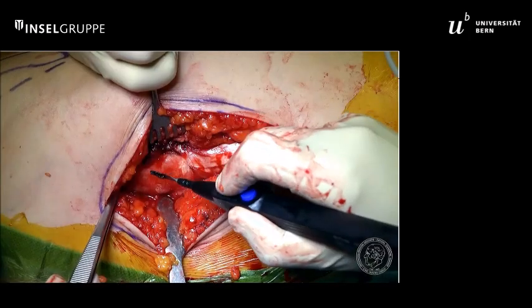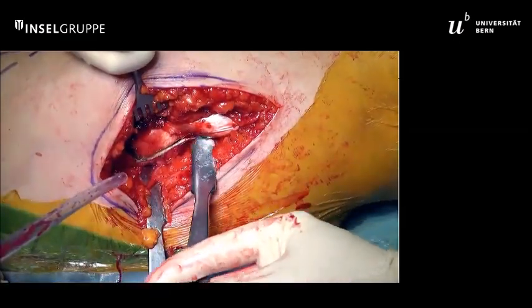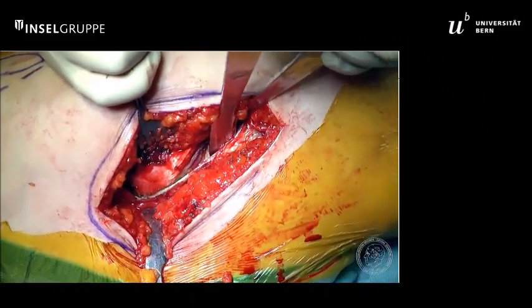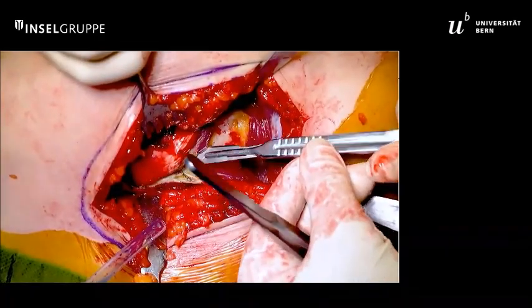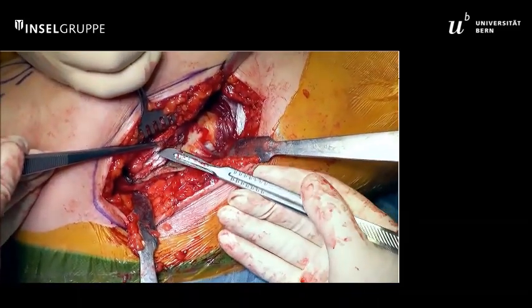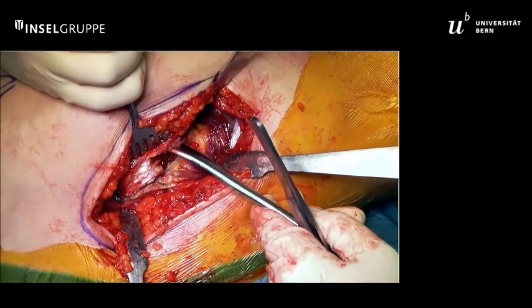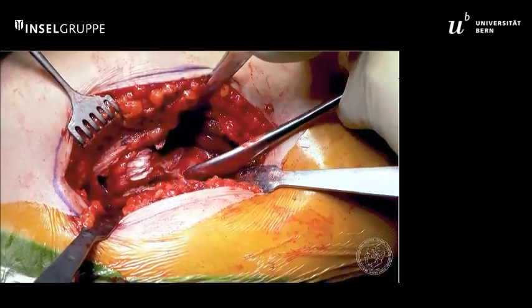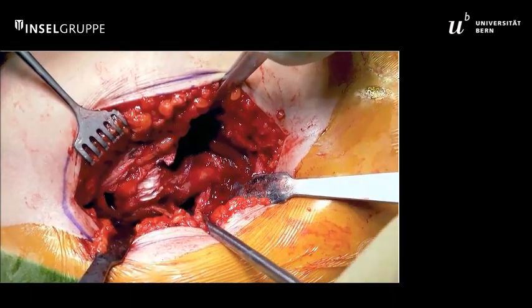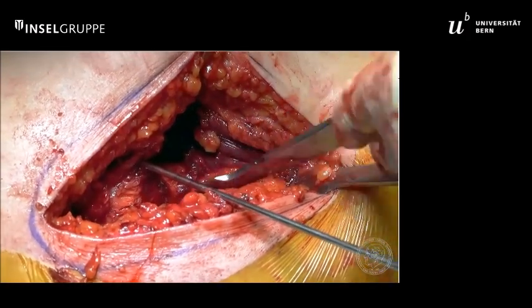The patient is in supine position. We perform a 10-centimeter longitudinal incision over the greater trochanter. The subtrochanteric area is exposed through an L-shaped incision, and subperiosteal detachment of musculus vastus lateralis is performed. Two Hohmann retractors are placed subperiosteally, and the lateral part of the greater trochanter is exposed by sharp dissection. Then the designated osteotomy area is circumferentially exposed to prevent damage to soft tissue. A K-wire is manually placed along the anterior femoral neck to check anteversion, and the position is controlled on fluoroscopy.